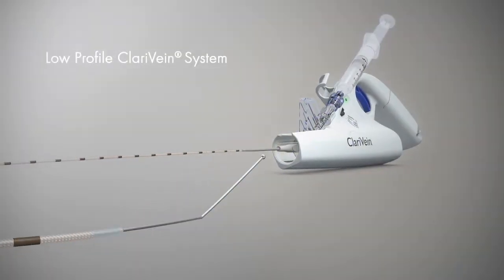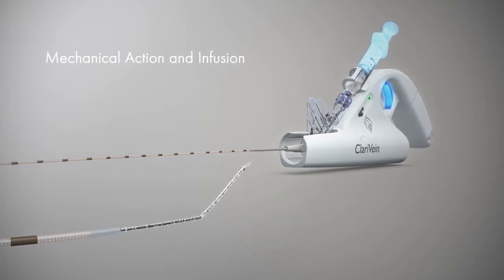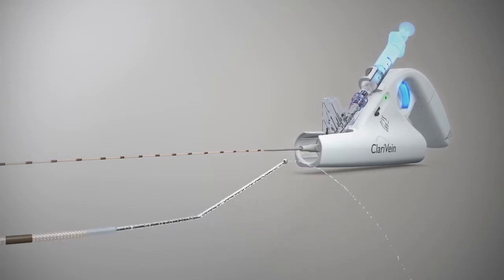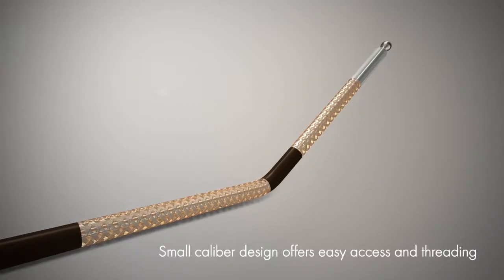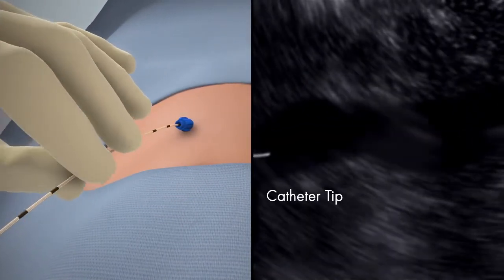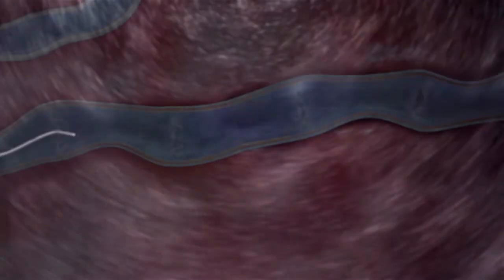The revolutionary low-profile Clarivane system combines mechanical action with the infusion of physician-specified fluid. The small calibre design offers easy access and threading. Typically deployed through a 4 or 5 French microintroducer under ultrasound guidance, the catheter tip shows brightly.